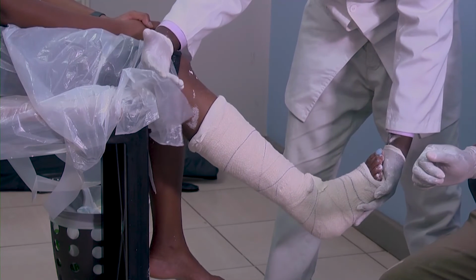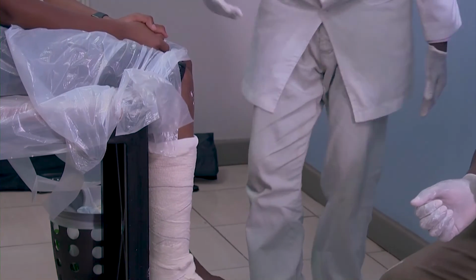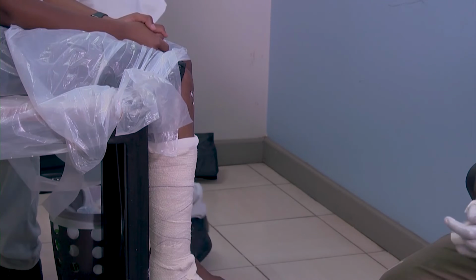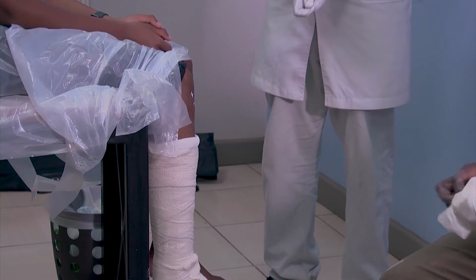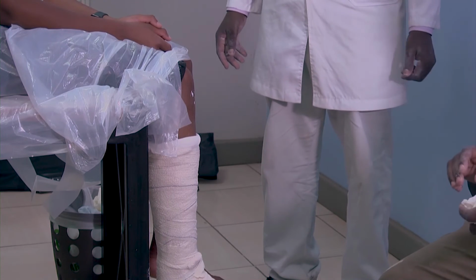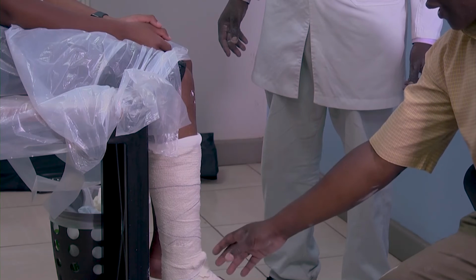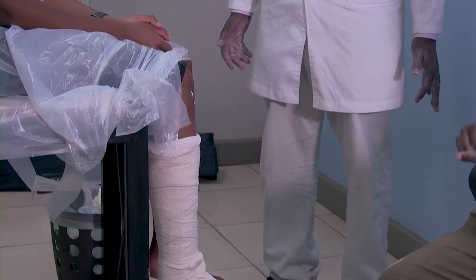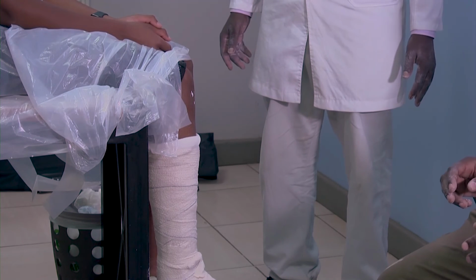Yes, usually it's temporary, especially for ankle fractures. But remember, we said in surgery that may be what we'll use initially. The extra stirrup sometimes provides even better stability. Just one point of note: when you put the extra stirrup, it's just on the side. Make sure it doesn't come right to the front, otherwise it's more constricting. All right, thank you very much.